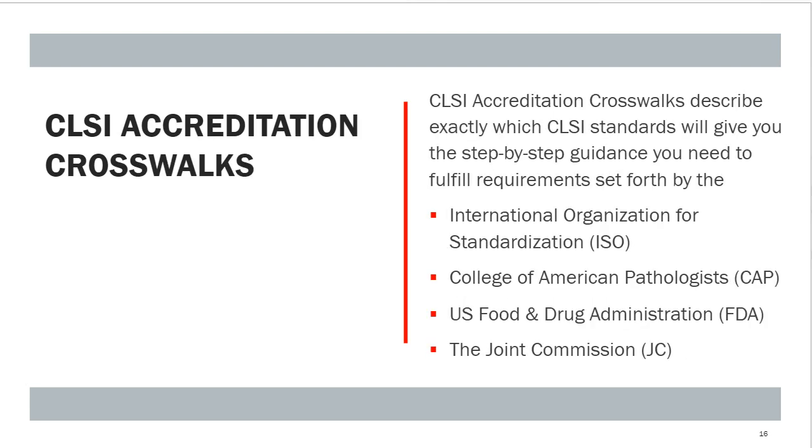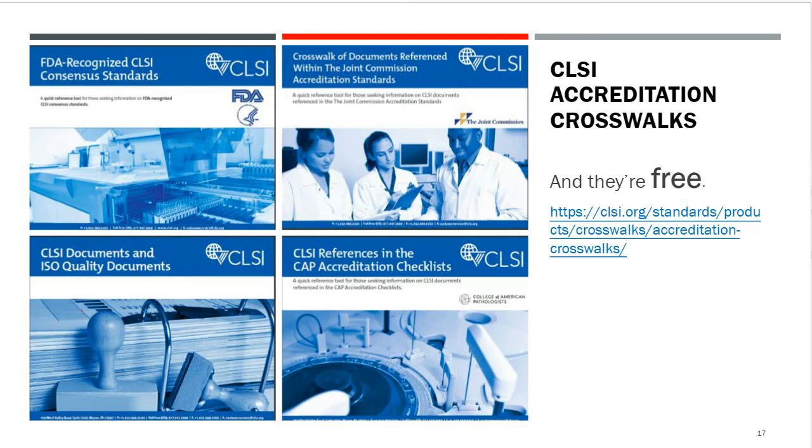We're going to show a few CLSI accreditation crosswalks. There are 4 of them, one each for ISO, CAP, FDA, and Joint Commission. These are the 4 documents. Again, FDA, Joint Commission, ISO, and CAP accreditation. Here's the website where you can get copies of these, and they're free. You can just go to the site and download them.